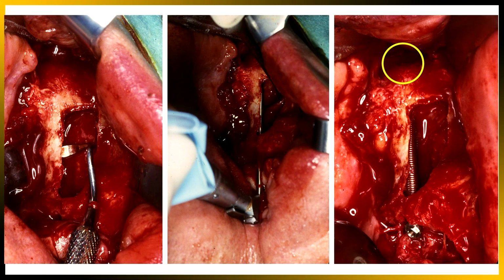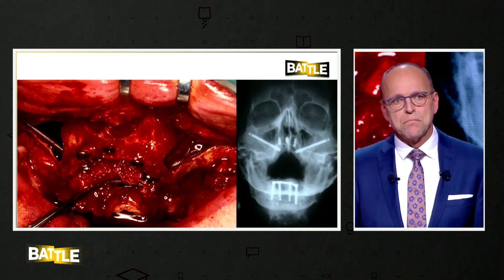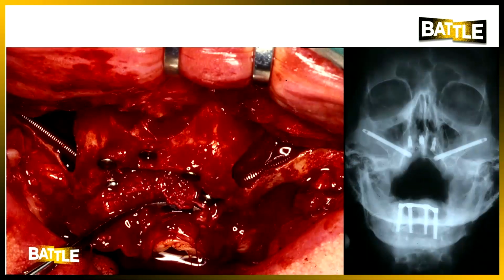You see, in order to be able to control the implant position, the little yellow circle marks the implant edge. So when you are finished with this procedure, you have an extensive dissection, you have a complete exposure of the maxilla, higher up even than the orbital floor, and this is definitely associated with significant treatment burden. So we have both concepts on the table, and we will battle these concepts and discuss them. But maybe let's first see what the audience prefers.